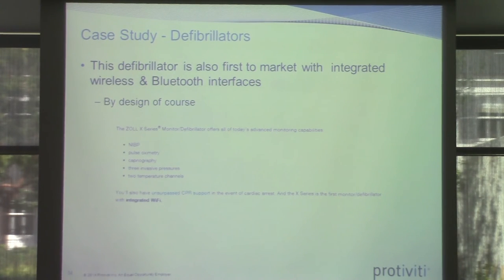Well, these types of systems, and it's not just Zoll that has this problem, it's the others, sit inside of an ambulance and have a 12-lead to do readings. The reason for the wireless is printing to a printer, and the reason they've designed it with cellular is so they can send that 12-lead information to the receiving ED prior to arrival. So there's a clinical reason why they did it, and of course that's why in the marketing material they're first to market with this. But obviously there are some unintended consequences, and when you have Bluetooth, wireless, and cellular, you should probably reduce your attack surface and pick one of those technologies instead of patching on and throwing everything in.